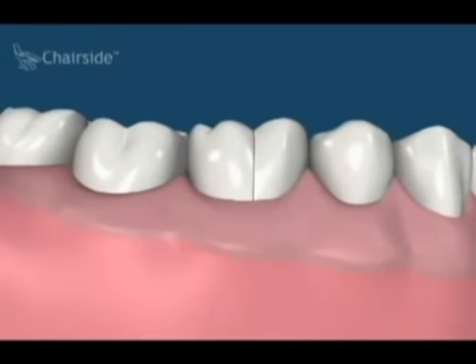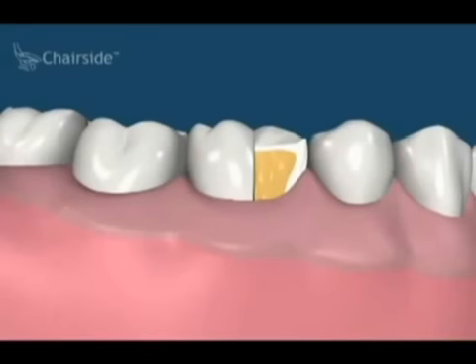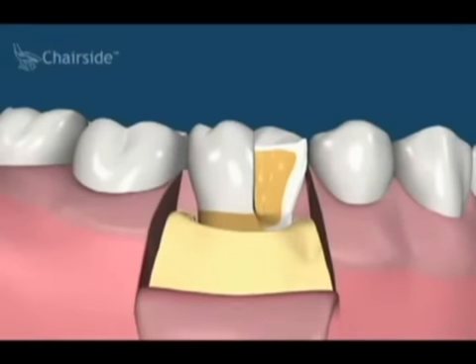In this situation, we see an entire cusp break off the tooth. If the tooth breaks below the gums, we cannot restore it, as in this case. To save the tooth, we can do several procedures. First, we raise a gingival flap for access, and then we reduce the bone level so that the bone is a certain minimum distance below the fracture.